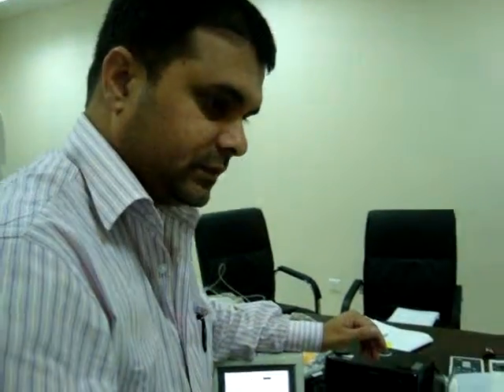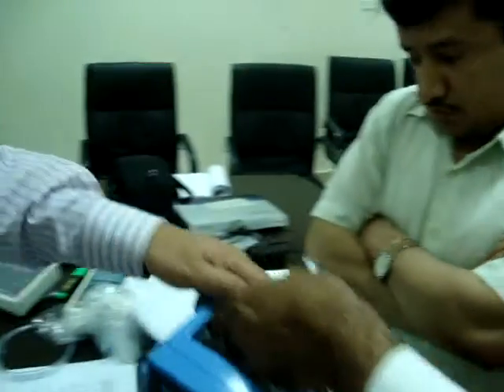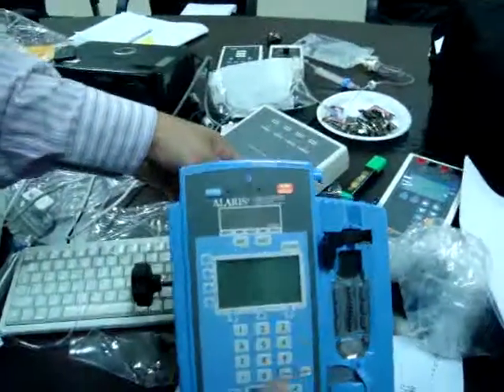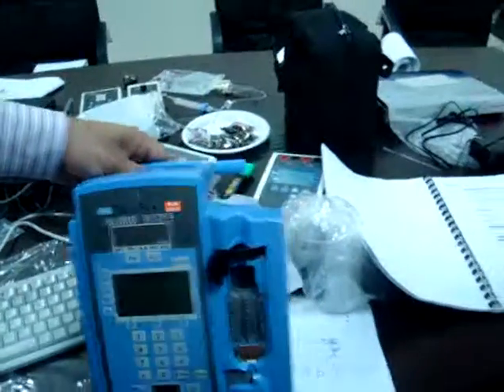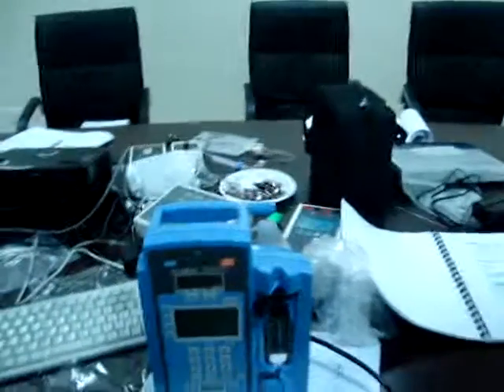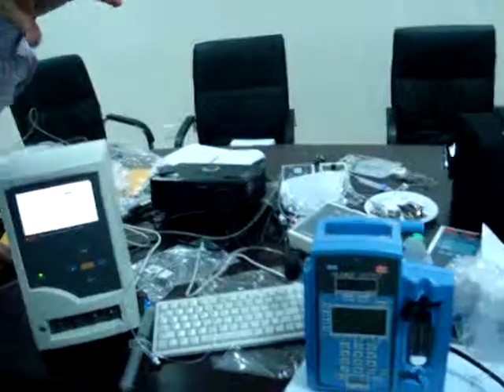If you see on the machine, you have the same here, primary, secondary. Primary is the main therapy. So you have 300 ml and you want to deliver for 4 hours. After 4 hours, you have to decide to continue or not to continue.